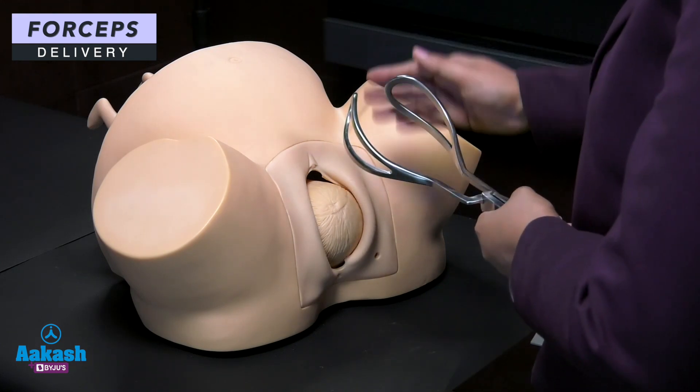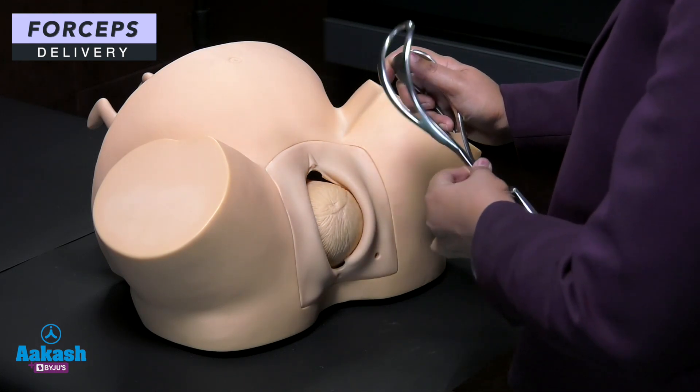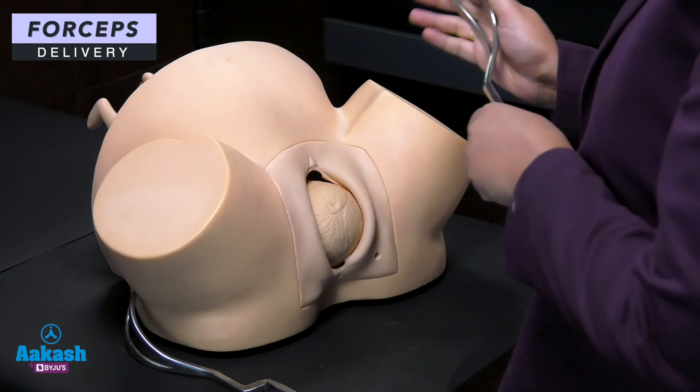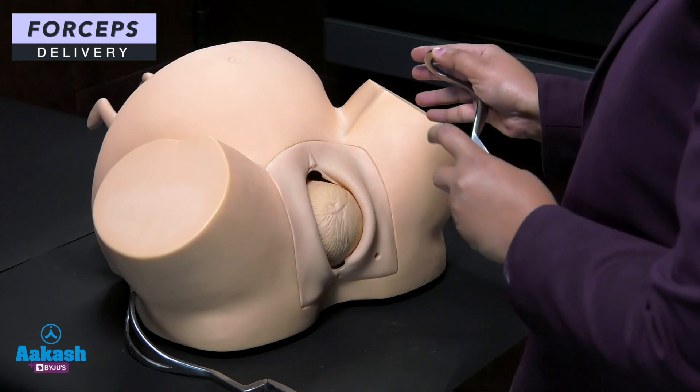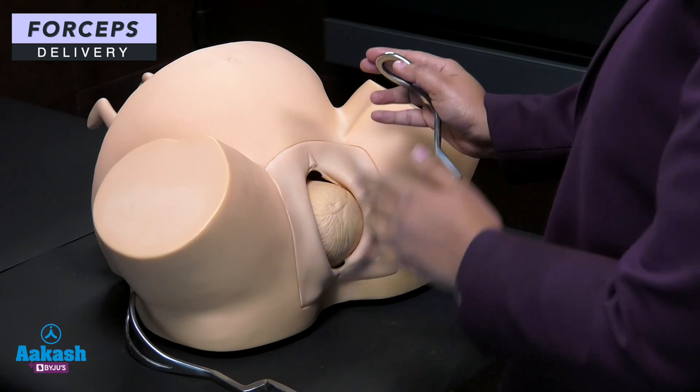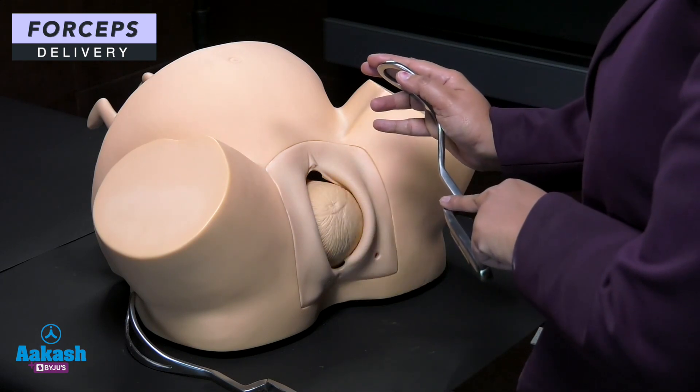This is your left blade. The left blade is inserted first. Why? Because the lock is facing upwards, so if you insert the left blade first, you can easily lock the right blade into it.